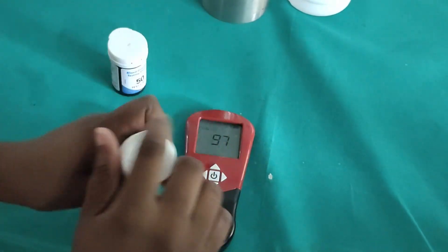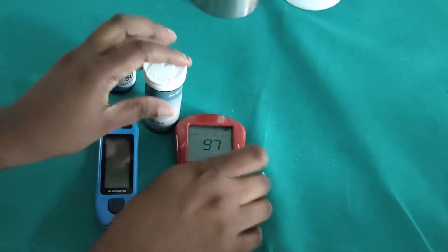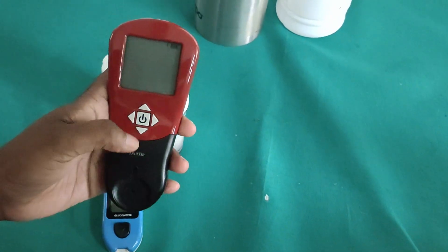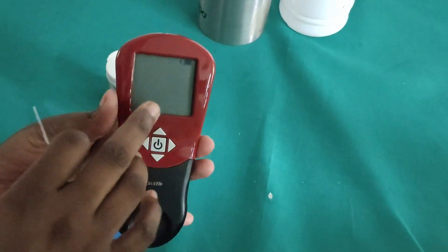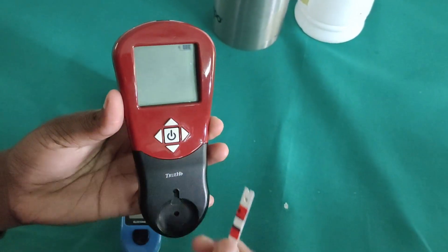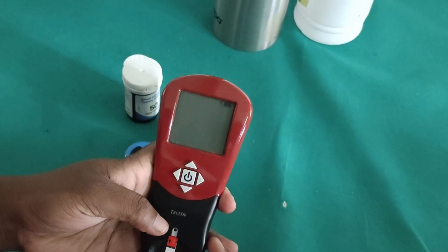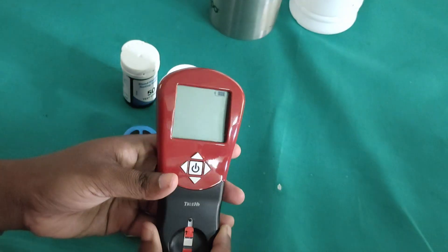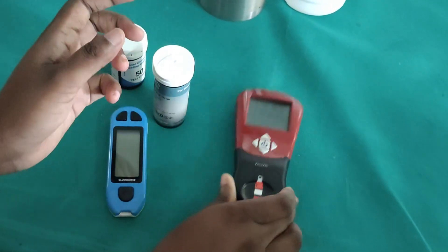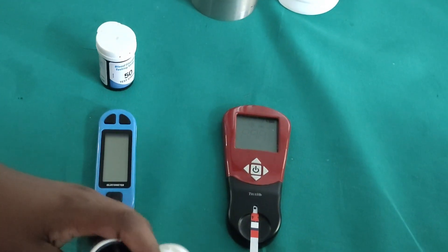After this, we have to take one strip from the HB strips bottle. Then we touch the power button and we can see a symbol glowing. It is showing that we have to put the strip in now, and then it shows the blood mark — meaning we have to drop the blood on the sterile area where the light is glowing.